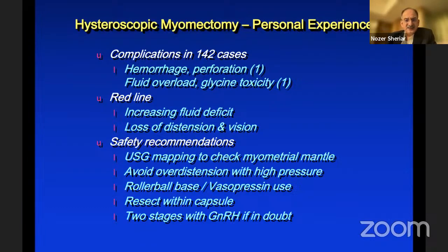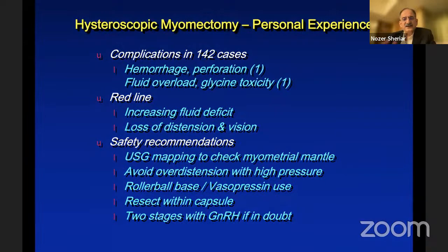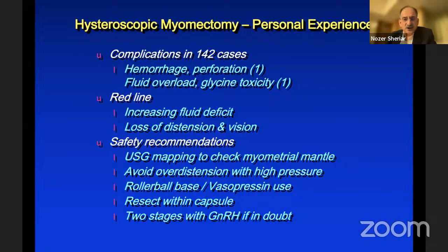Put in 5 ml. Wait, see if bleeding is happening. Make it 7 ml. At some point between 5 and 8 or 10 ml, the bleeding will stop. Do not go crazy just because the bulb has a capacity of 30 ml.